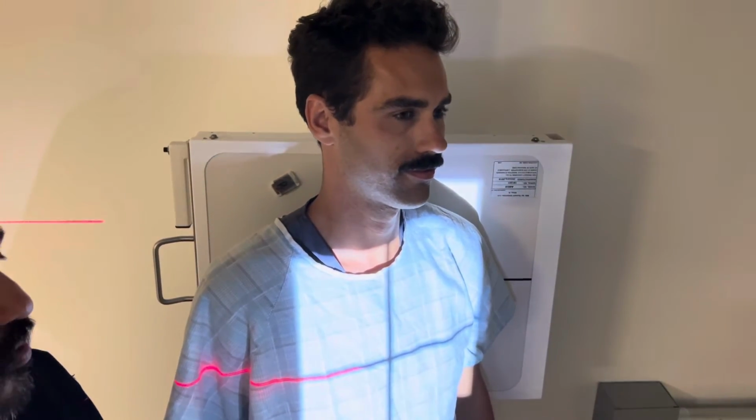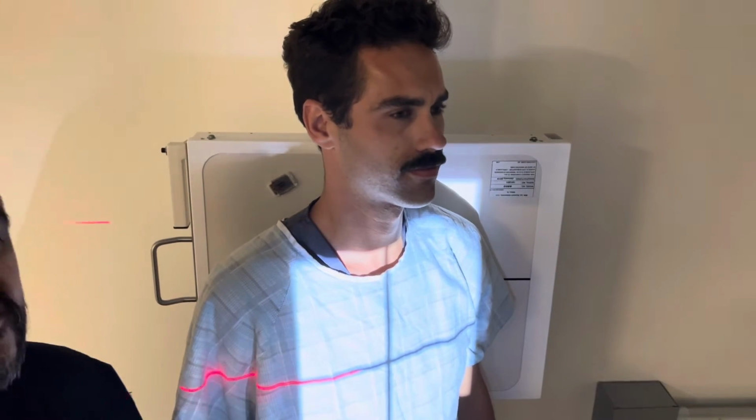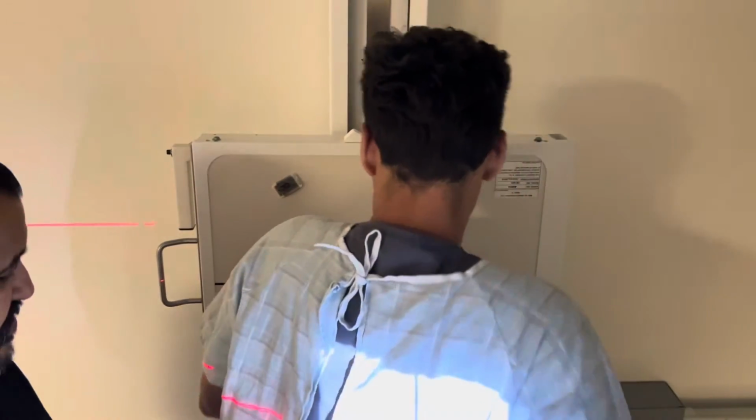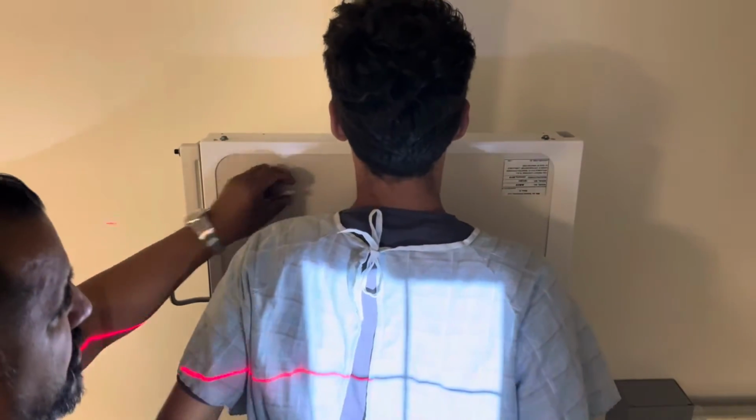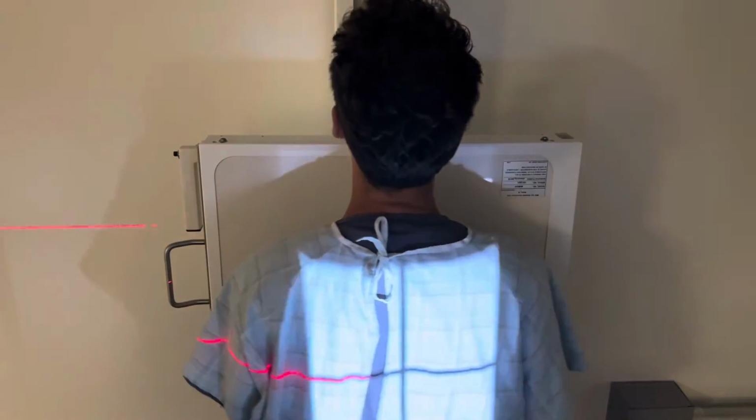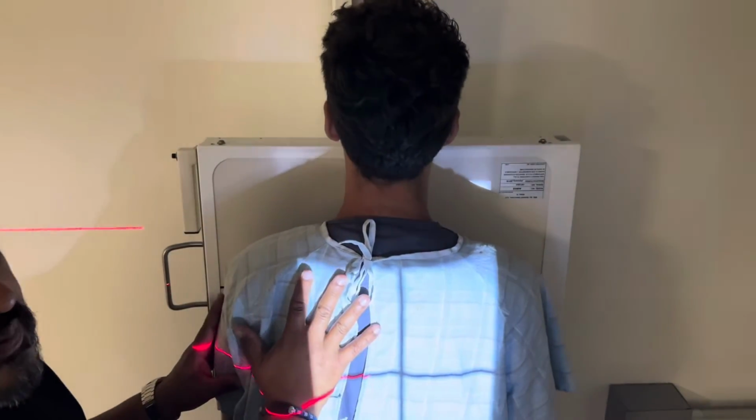All right, so now what we're going to do is we're going to pretend he has an anterior rib injury. So we're going to have you turn and face the board. We're going to have you put that shield on your back. Just kind of turn it. There you go. All right, so I got my right marker here. I got my left marker here. All right, so now I just got to remember that he's turned in a PA.